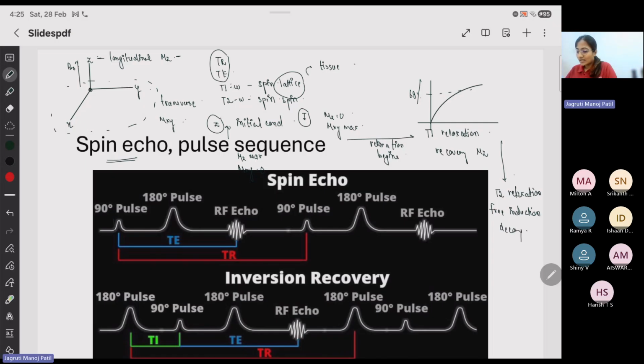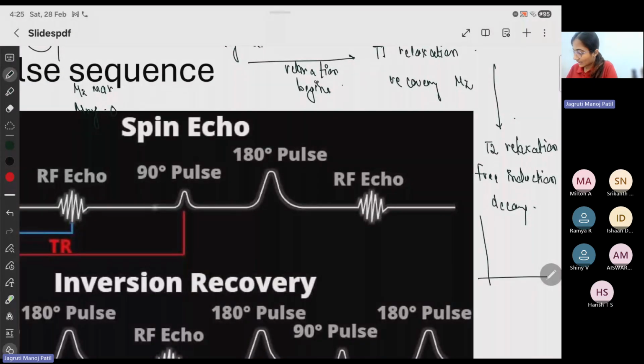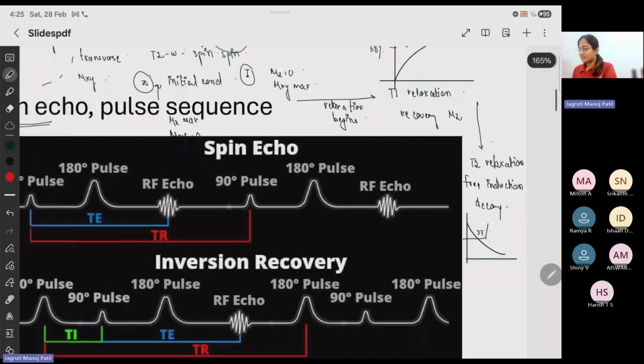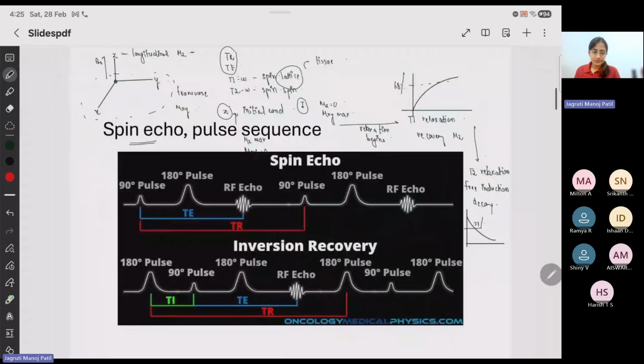Okay, now when they are trying to relax, for them to relax only means for them to decay in that axis. So for them, it would be an exponential decay, similar to that of a capacitor discharging. This discharging effect will lead to something like 37% loss of their energy in that particular axis. Okay, now when this effect is occurring, how do you compare it?